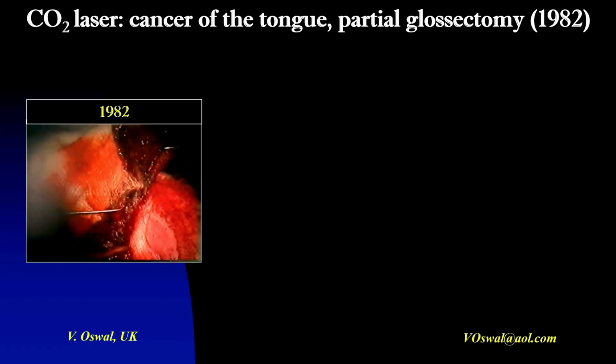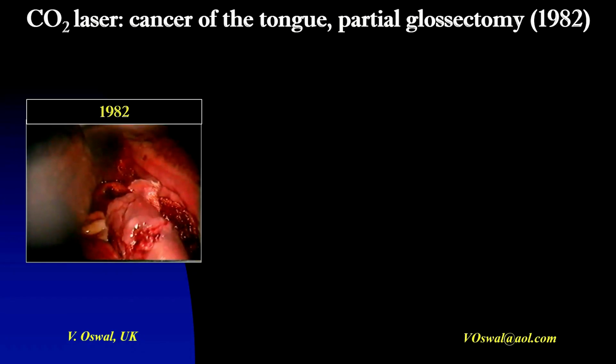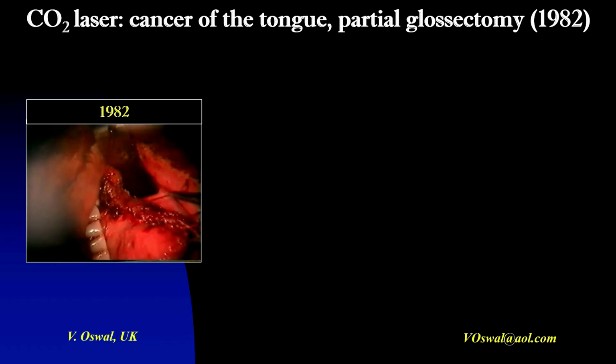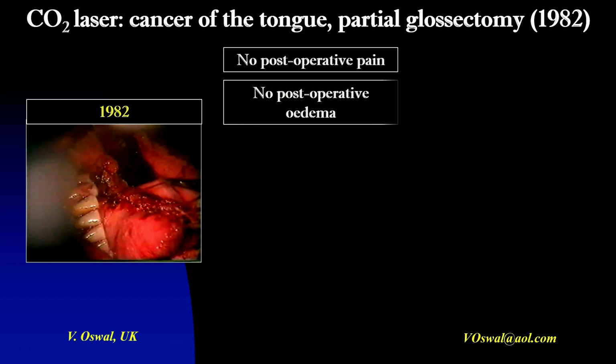Another major advantage of using the laser was intraoperative hemostasis. It provided an excellent demarcation between the diseased and the normal tissue. I was able to suture the wound without any need for grafting. As with the first two cases, there was no postoperative pain or edema.